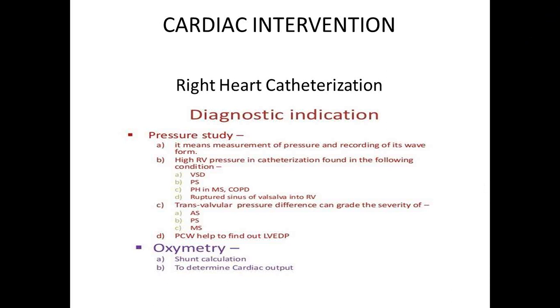right heart pressure measurements are very important, because if the patient is in shock and the right heart pressure is very reduced, then there are a number of conditions that can cause that, but you have to give the patient fluid. You have to give the patient fluid, as opposed to a situation where the patient is in shock and the pressures are elevated. That's usually due to something else. So the diagnostic indication, you want to diagnose something.